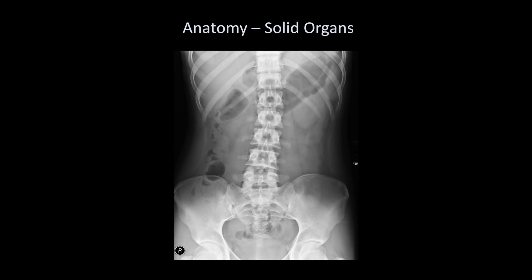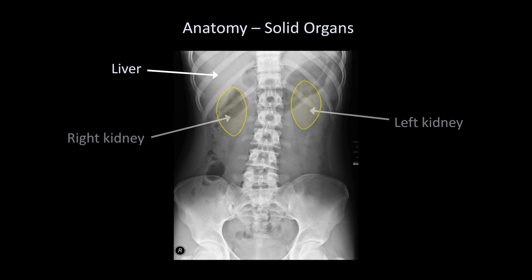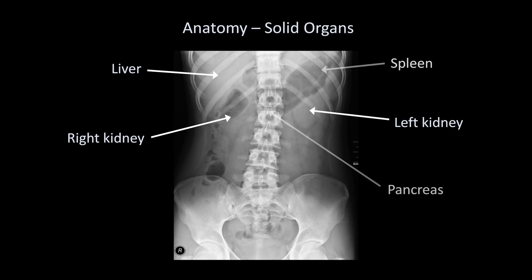Next, let's look at the normal anatomy of solid organs on abdominal x-ray. As mentioned earlier, the solid organs are all poorly visible on plain radiographs. In this case, we can identify the location of the liver. The kidneys are a little more subtle, but a normal spleen and pancreas will not typically be visible on plain films.